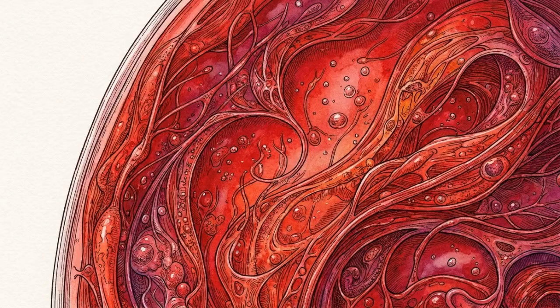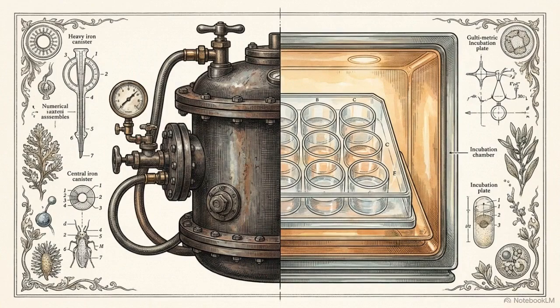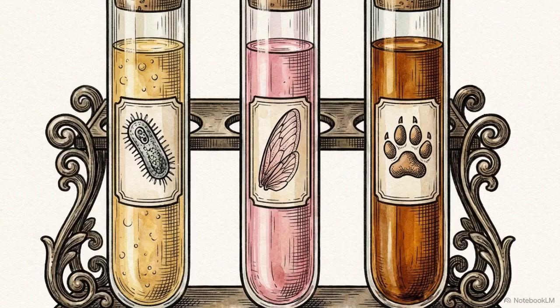As eukaryotic complexity scales, media preparation shifts from a chemical mixture to a delicate, environmentally controlled simulation of an animal's bloodstream. The vast spectrum of cellular environments required across biotechnology demonstrates that biological domains cannot share a single universal growth medium. Every species and application necessitates its own specific biochemical profile.